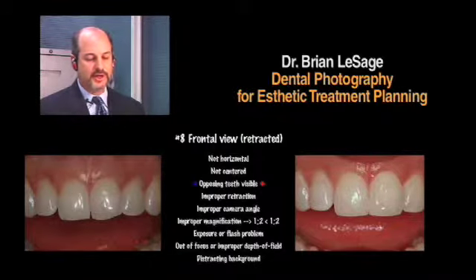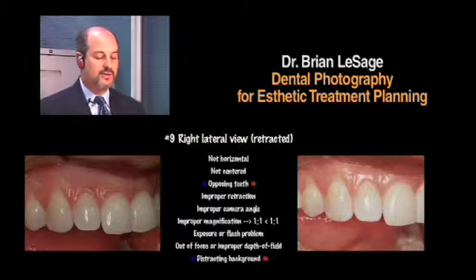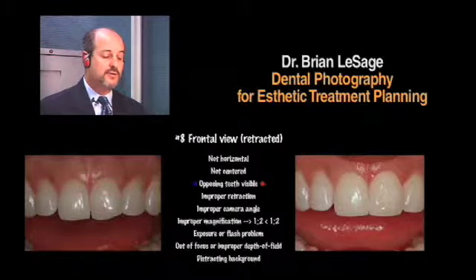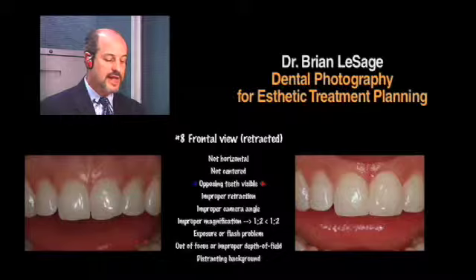So here you can see the bonding, corrected it. Not the best bonding, this was quite some time ago. Become a better bonder. This is 1997, these pictures were taken in. I think it's an adequate bonding job, but certainly today I would do it a lot better and a little bit differently.